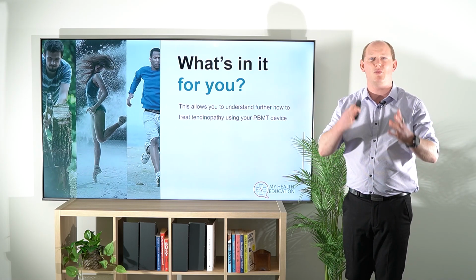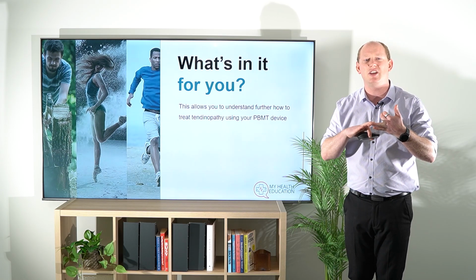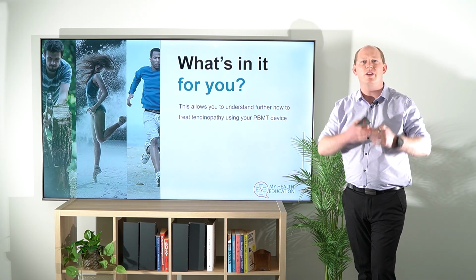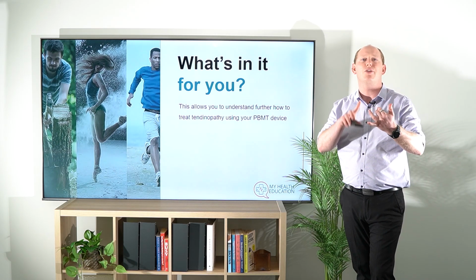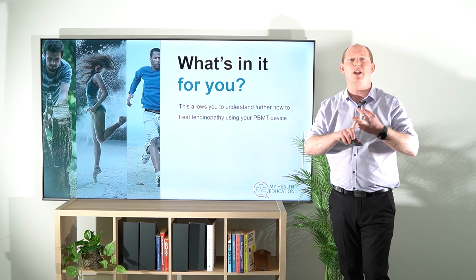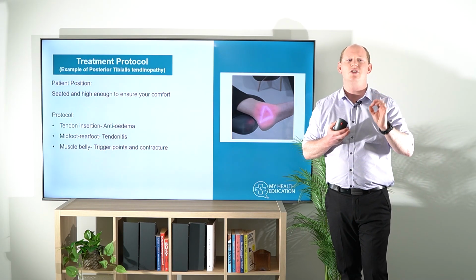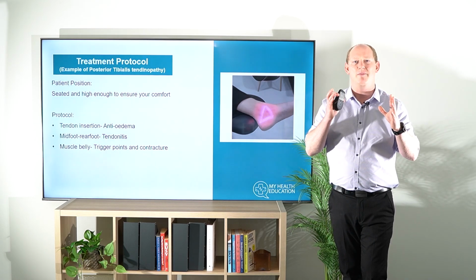This is how we need to think more holistically about not only the insertion, but potentially that mid tendon, as well as the muscle belly there as well. Now, of course, this is all in conjunction with all of our other complementary therapies that we're going to be doing at the moment, whether that's orthoses and definitely strengthening, eccentric strengthening, but bringing it all together with an aspect of PBMT here.